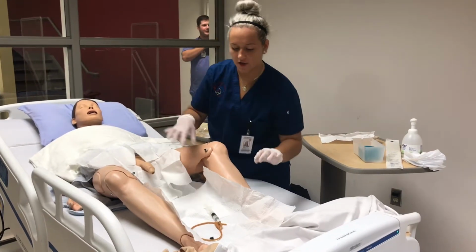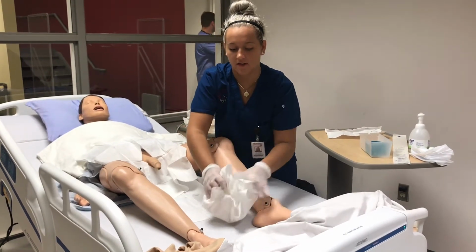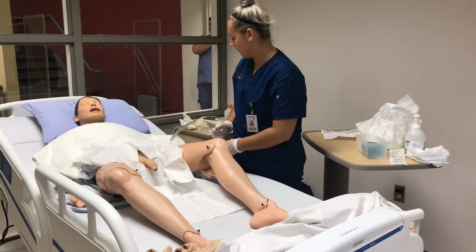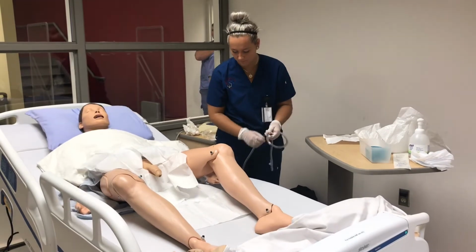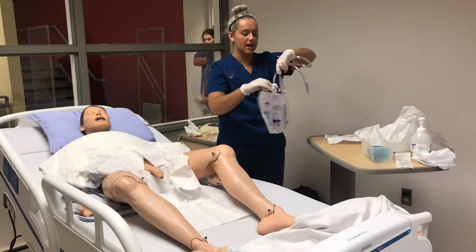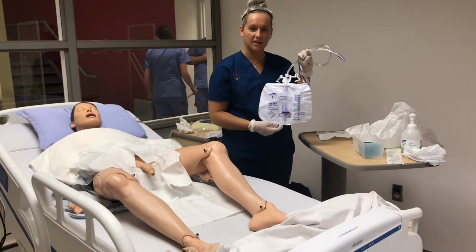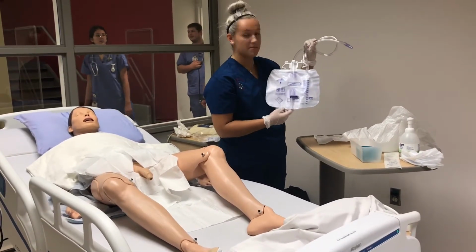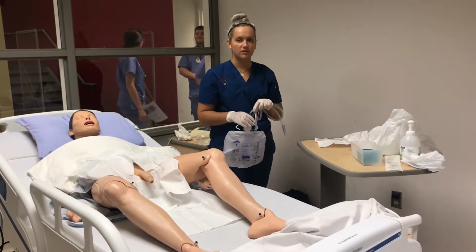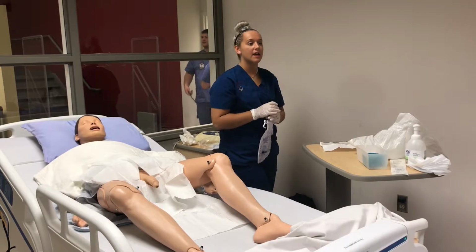Okay, and then you're going to want to discard the catheter. You just take this and discard it in the proper garbage. And then it's time to take the drainage bag. You detach it from under the bed. Once you have the drainage bag, usually the bag would be pretty full, but in this case it's not. You would inspect the urine, its color, the amount of urine, so the urinary output, and the smell, and then you would properly dispose of it into the toilet, and then properly dispose of your urinary bag in any sort of trash can.